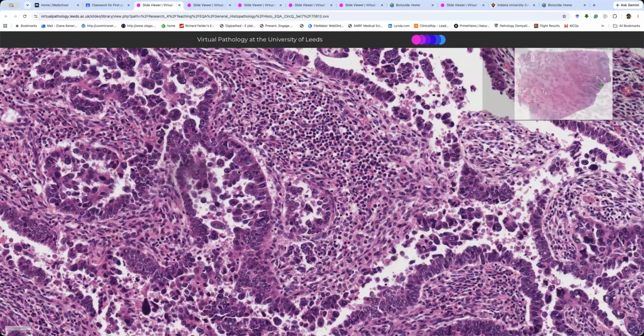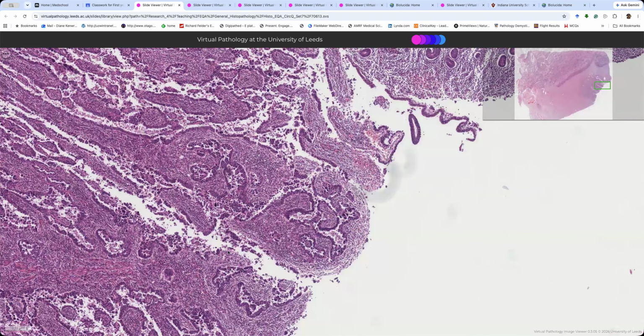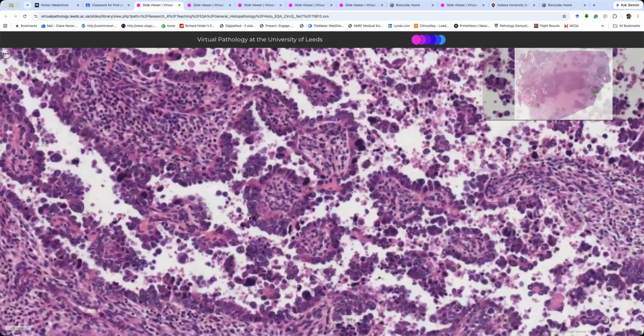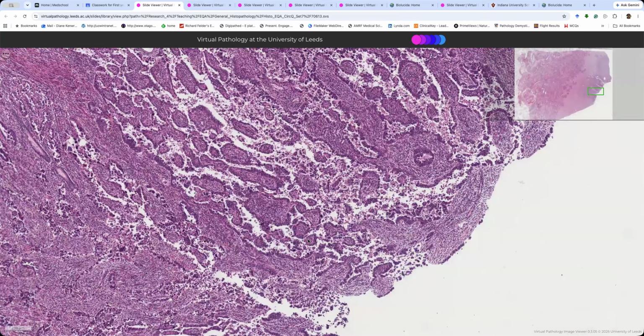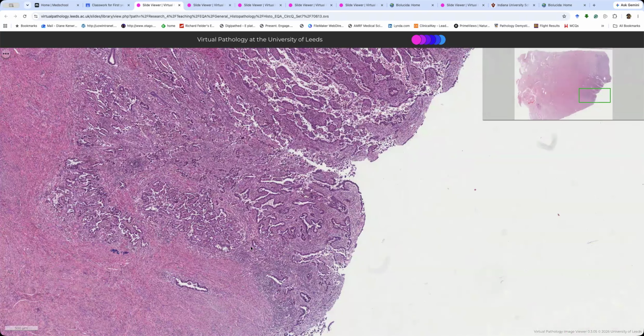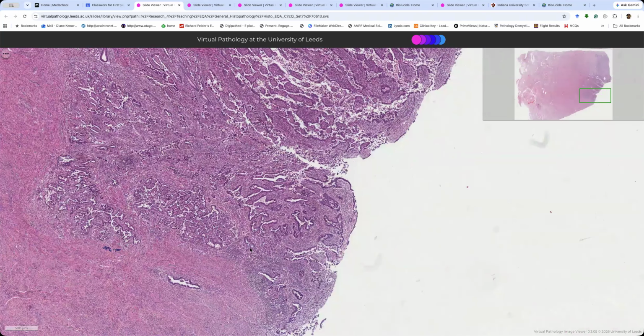But here's the thing. Quite a lot of serous carcinomas will have just glands. Down in this bit, we do have true papillae. So before we had these papillae without cores, but here we do have papillae with cores poking into a space. So you can get just glands, just papillae, or a mixture of the two, but they always, always look horrible. Why do they always look so horrible? Please tell me in the chat. Why do they look so absolutely dreadfully bad?